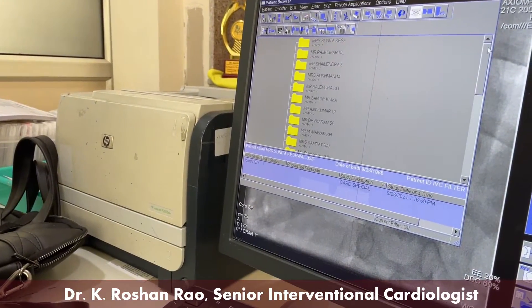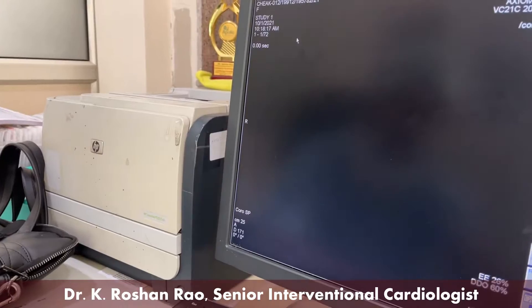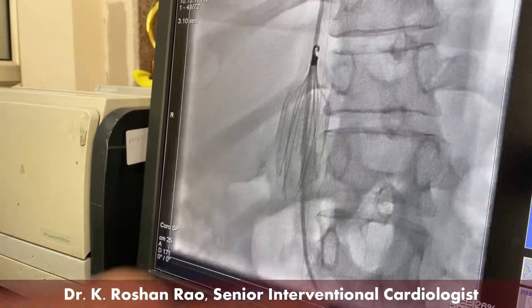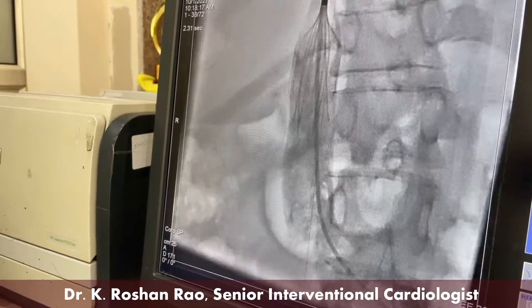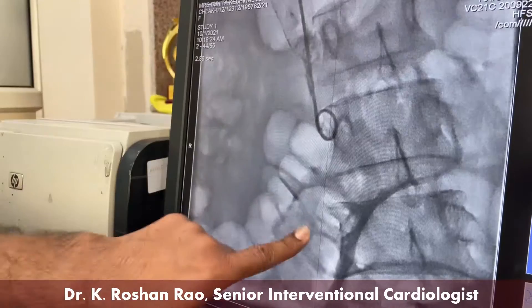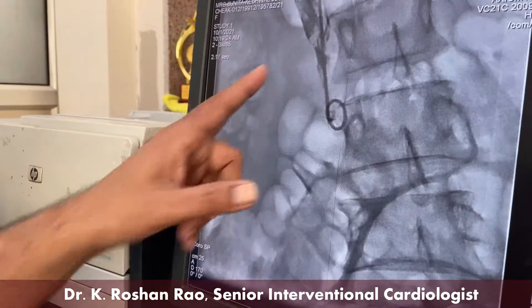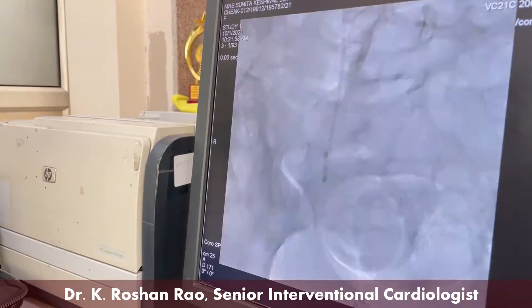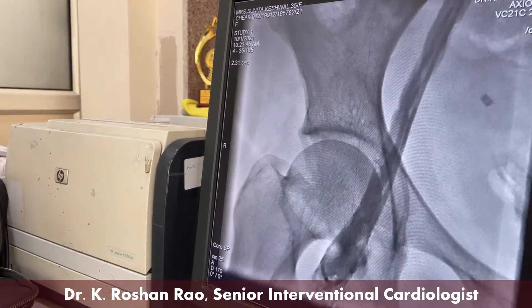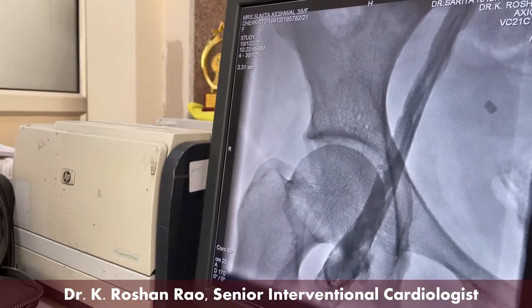This is today's shoot, and I was very happy to see this: our pigtail was able to pass through the left-sided iliac vein very comfortably. If you see the diameter of the IVC, it is very large now, meaning the thrombus along the wall has been diluted. We were able to cross through, and this is the thrombus on the right-sided iliac veins — see how constricted and low-flow it is. This is the external iliac vein, and then we went to the common femoral vein where flow is much better than earlier, though there is still a large thrombus burden.